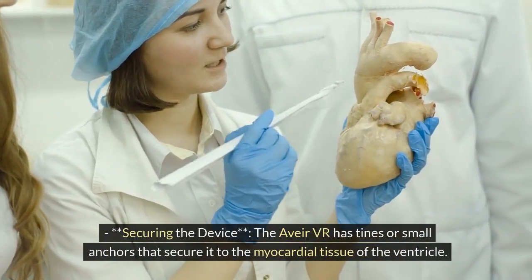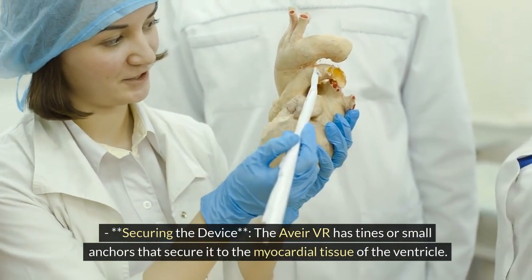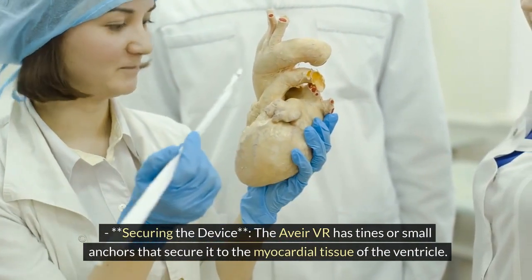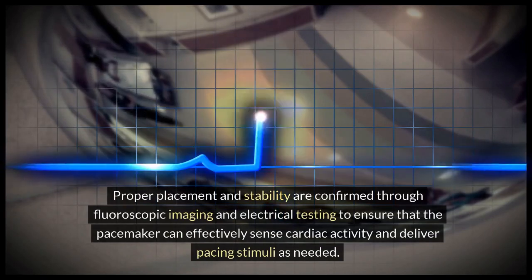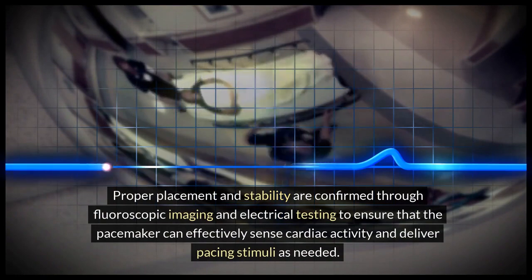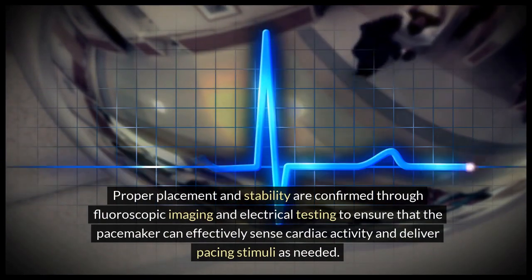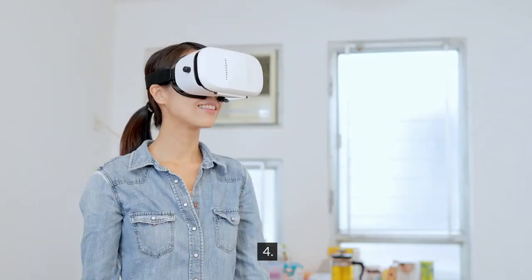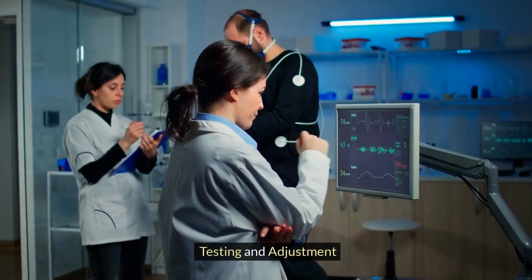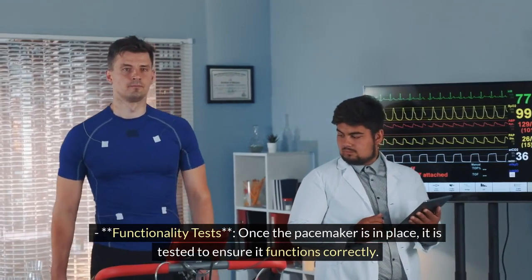Securing the device: the Avia VR has tines, or small anchors, that secure it to the myocardial tissue of the ventricle. Proper placement and stability are confirmed through fluoroscopic imaging and electrical testing to ensure that the pacemaker can effectively sense cardiac activity and deliver pacing stimuli as needed.